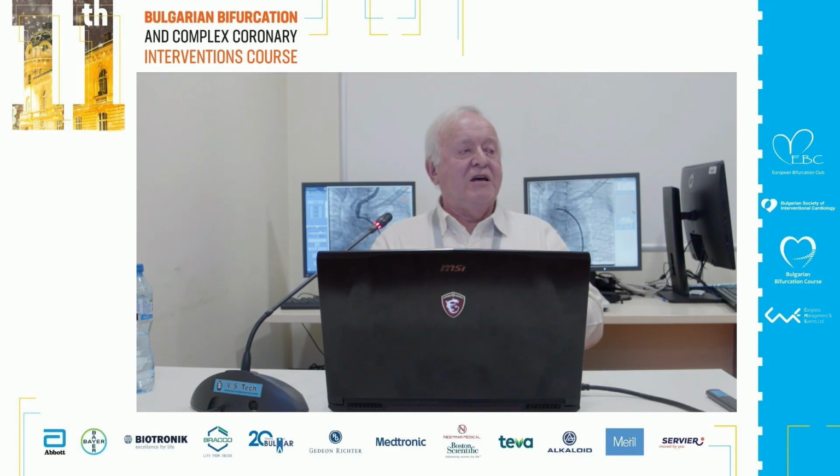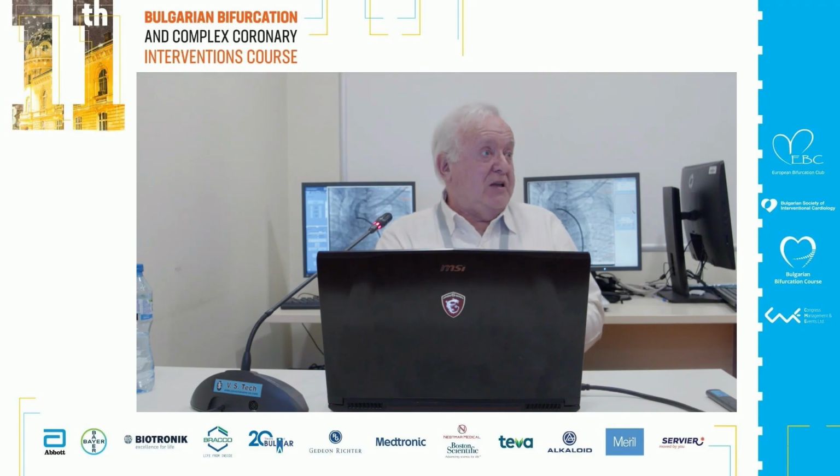So this is important. You learn a lot of things with IVUS that I don't know. At the end, I'm not absolutely sure that this is well apposed. I try to do it, and I imagine it is, but I don't have the proof. And IVUS is good for this, and OCT also.